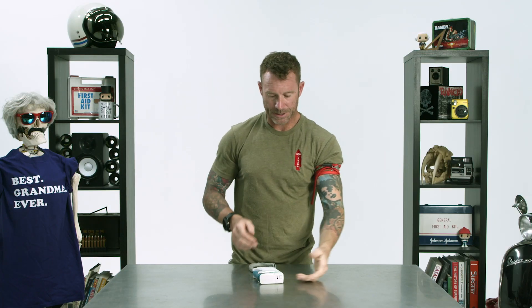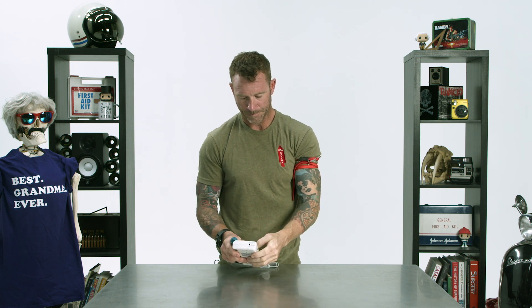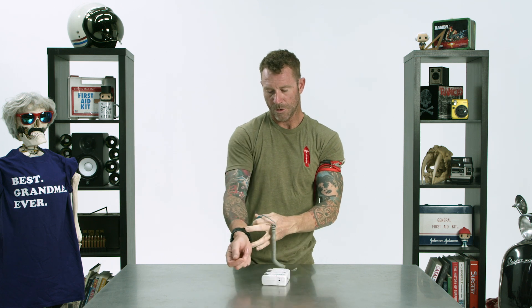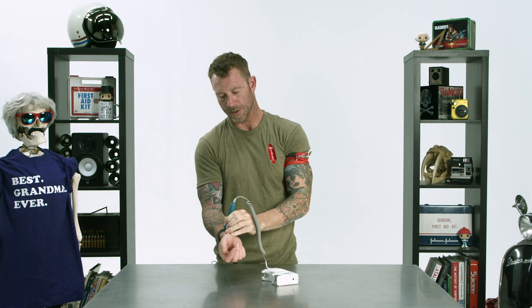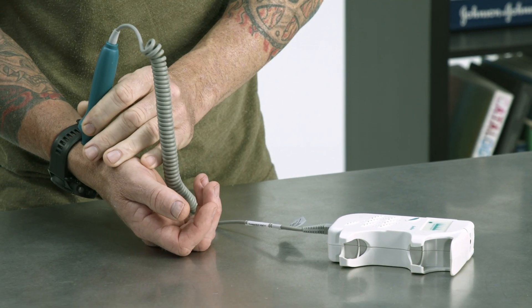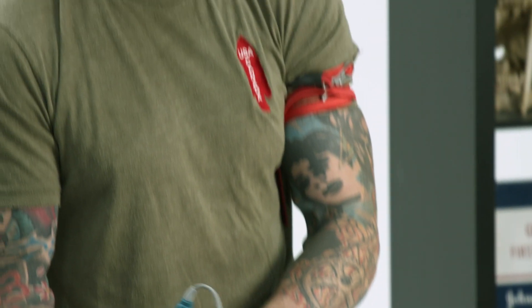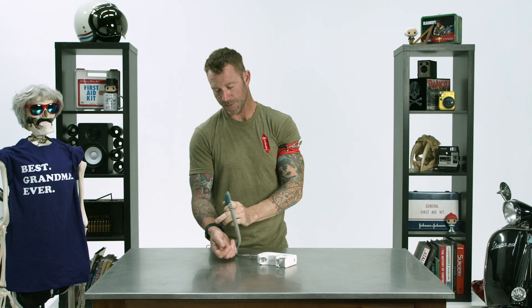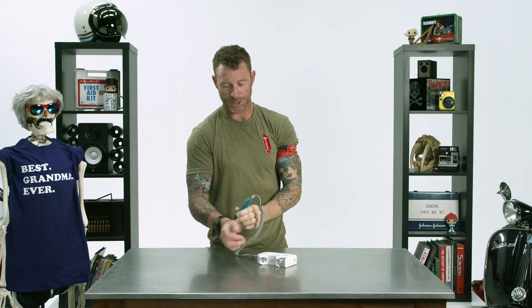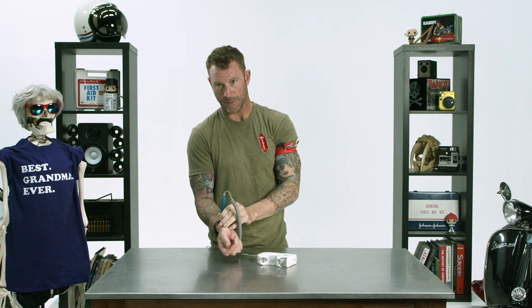Let's check it out and see if this thing works. First, we'll do my right side so you can hear what the pulse sounds like. You can hear that little pulsating sound — every time my blood is being pumped through my artery, you can hear the little whoosh as it goes underneath the Doppler.